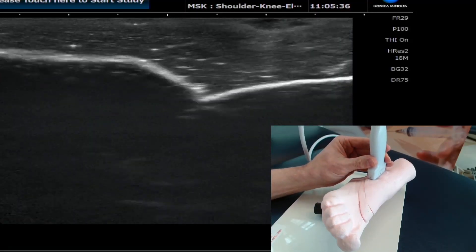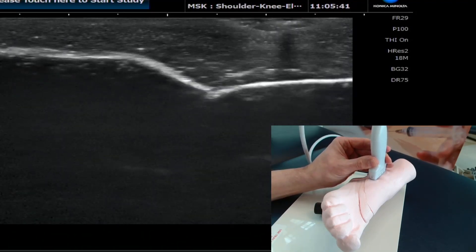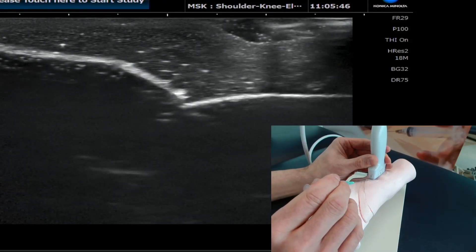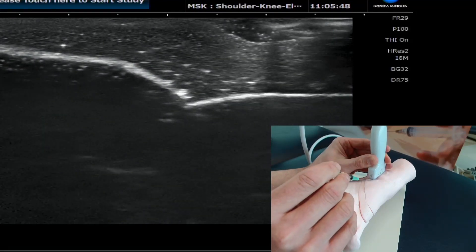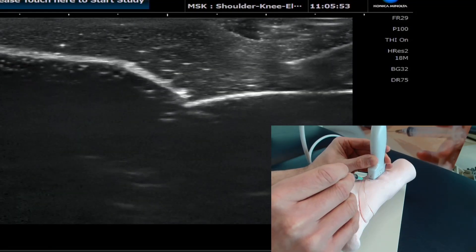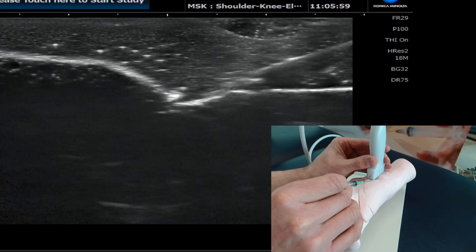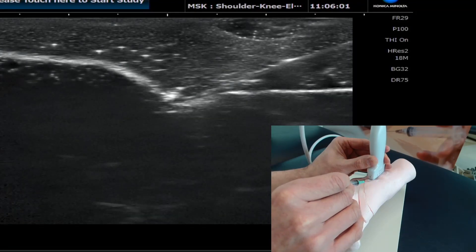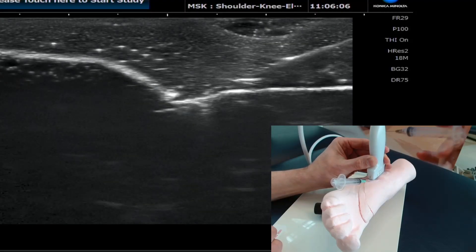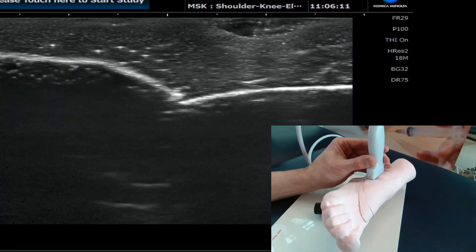We're going to get our needle into that area nicely using this phantom. I'll introduce the needle just away from the probe face, then advance it down clearly, keeping that needle tip nice and bright — as we've always emphasized. It's a very superficial technique when doing these ankle injections in this position, and it works very well.